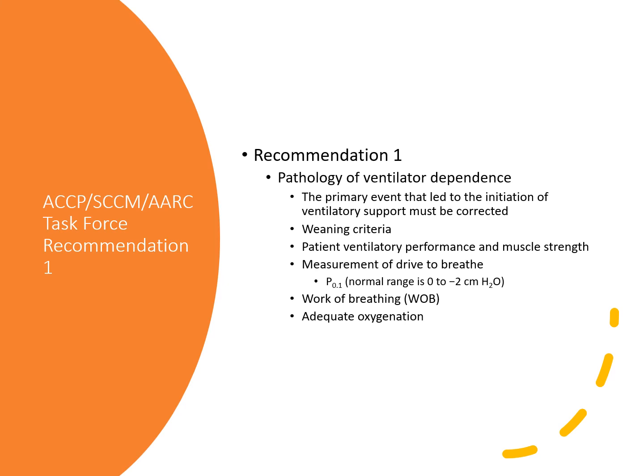Even the RSBI, which is the most frequently studied and one of the more reliable tests for looking at weaning status, you're just doing the frequency over the tidal volume in liters, right? So frequency over tidal volume in liters, so decimal point. If they're on 350 mLs, and let's say it's a rate of 20, so it's 20 over 0.35, right? You take this 1 minute after disconnecting a patient and look at their spontaneous breathing from the ventilator. You usually had a Wright's respirometer, you'd get a minute ventilation, count the respiratory rate, and then divide the minute ventilation by the respiratory rate to get their average tidal volume. Then you use that tidal volume in the RSBI.